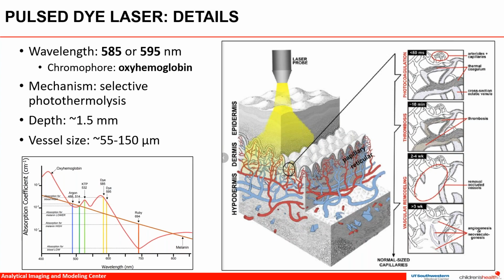So what exactly is the pulsed dye laser, and how does it treat these lesions? The pulsed dye laser uses a high-energy source of visible light to excite a certain dye to a state of being able to emit stimulated radiation. Light can either be reflected, transmitted, or absorbed by a target, but absorption is what's responsible for clinical effect because it's converted to thermal energy in the targeted tissue. The wavelength of the laser light is preferentially absorbed by specific chromophores, as seen in the absorption coefficient chart, which allows the laser to selectively target specific structures.